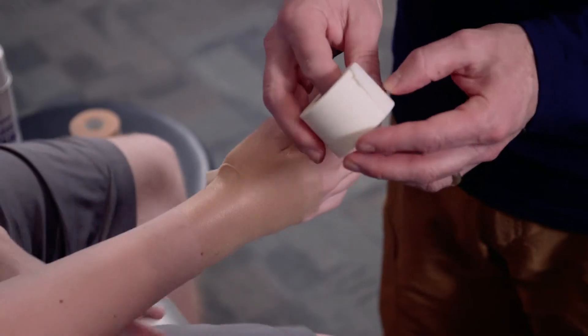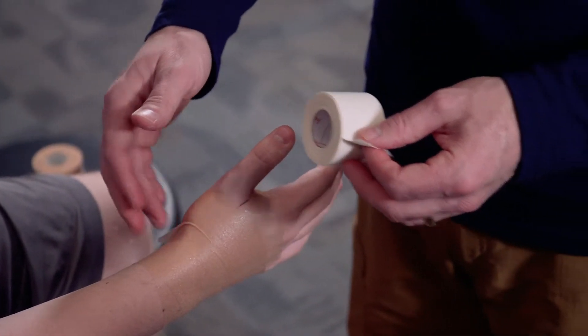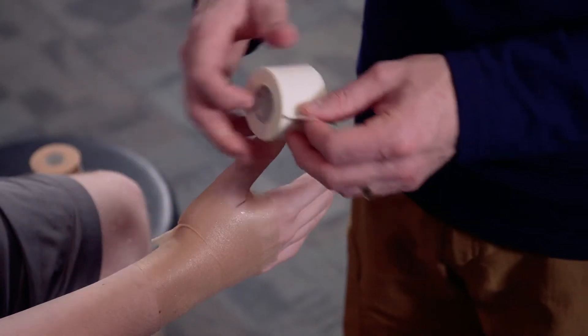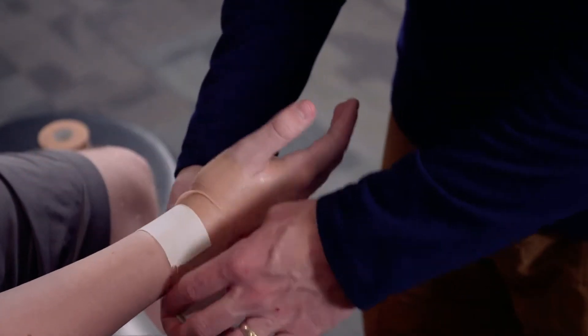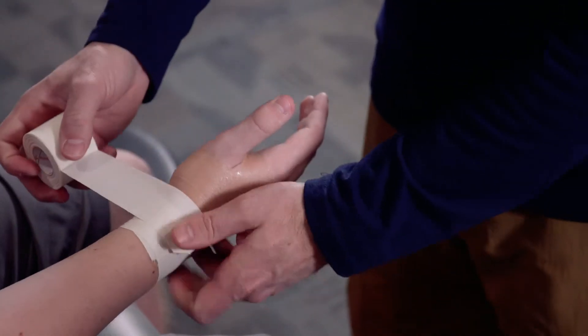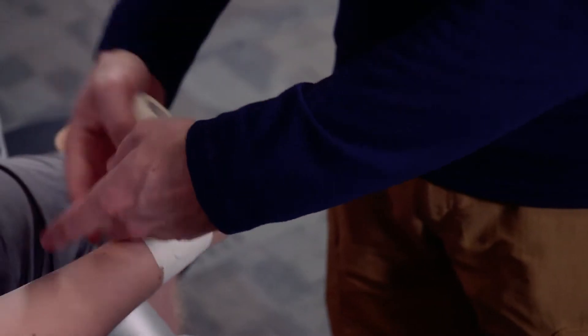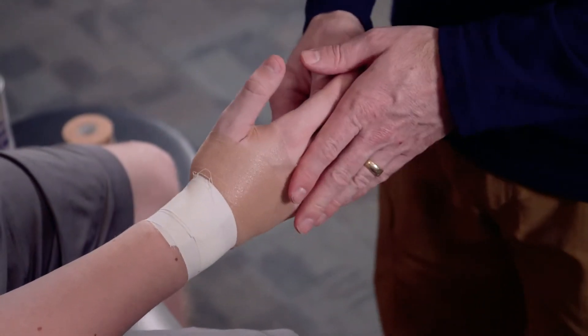We're going to take our one and a half inch linen tape. We're going to apply a couple of anchors directly right over the wrist, not too terribly far down, not too terribly tight. We don't want to cut off any significant circulation to the wrist, and those are kind of nice and secure.